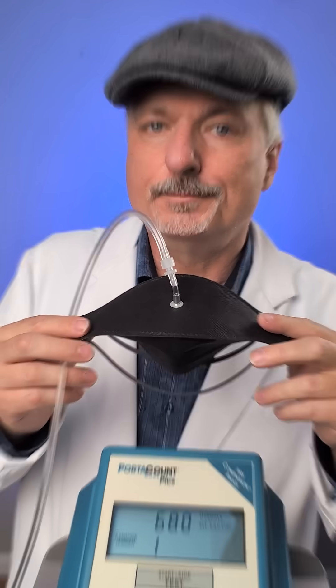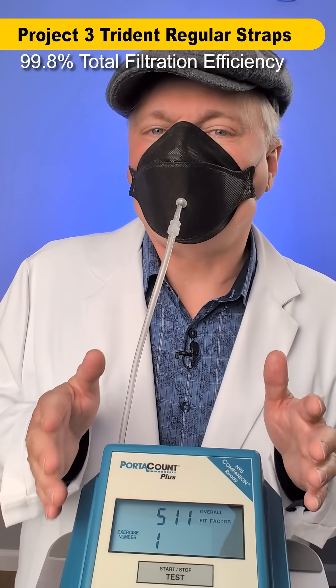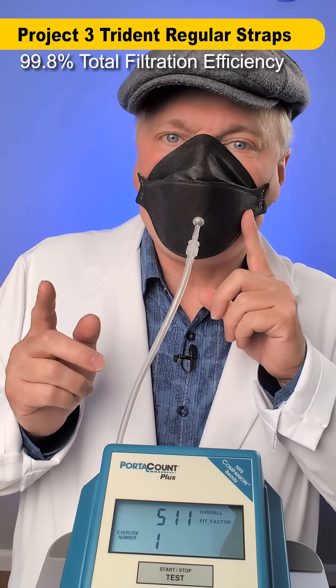Now the regular straps version: 511 is extremely protective — 511 times cleaner of submicron particles — but these regular straps are not feeling as good, and they're not necessarily giving me better protection.